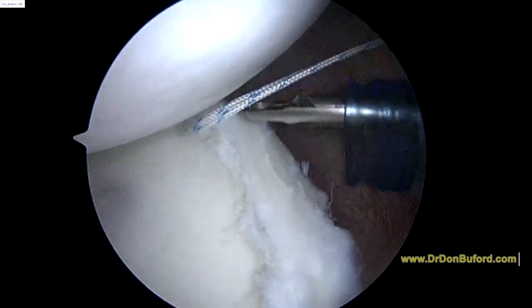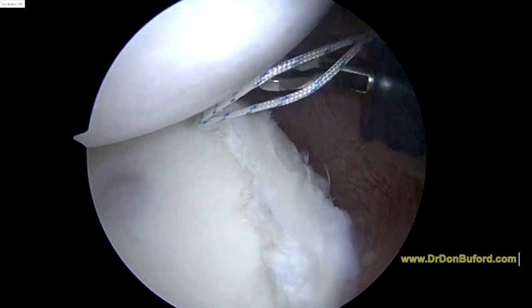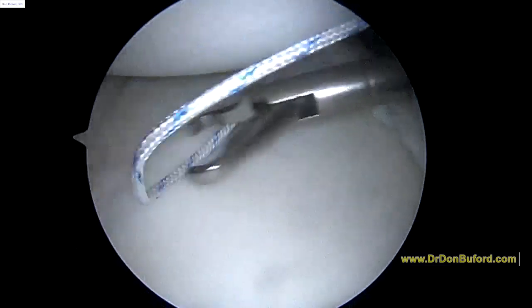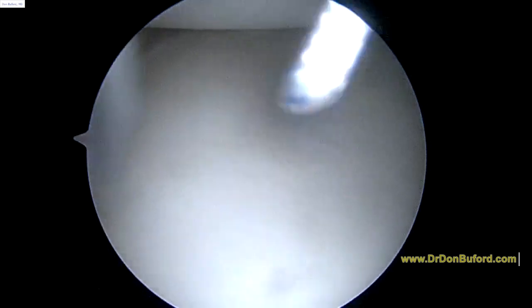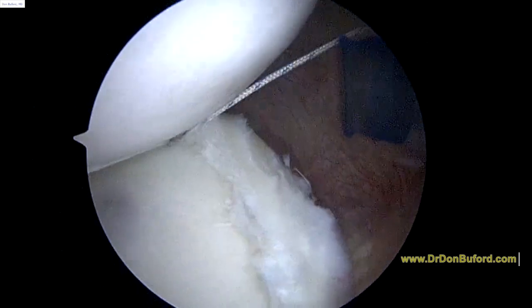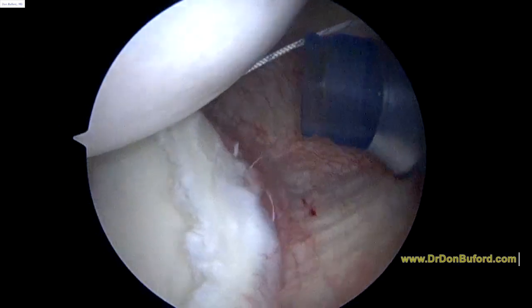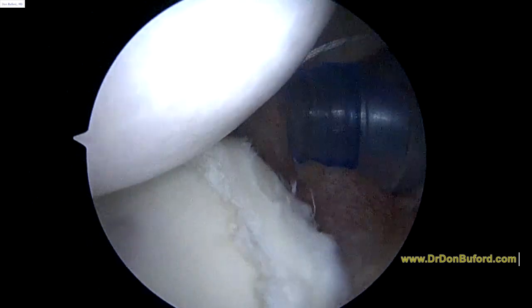So we've got our anchor in. You can see that. We're going to take one of the sutures out the front. The front is on the left side of the screen, as you see there. We'll push in our gray cannula and retrieve this. Hold the cannula tight. Just like that. And now we're ready to make our first stitch. We'll take a grasper in the front of the shoulder. So hand that. Other way. Rasp to me.